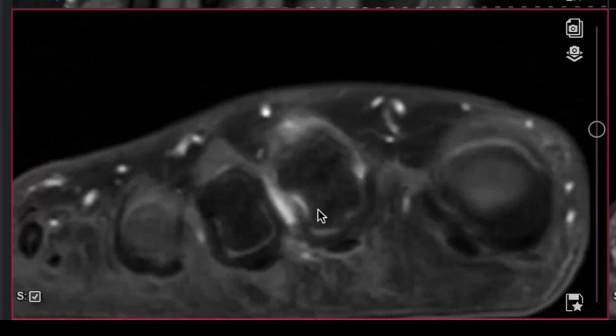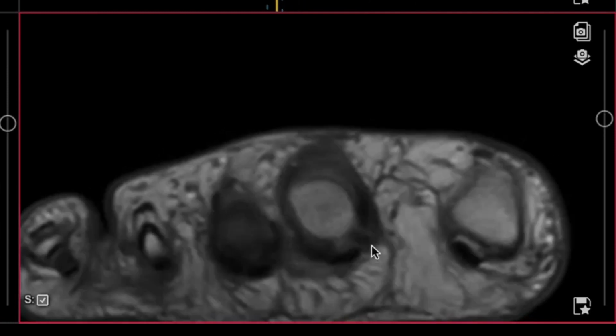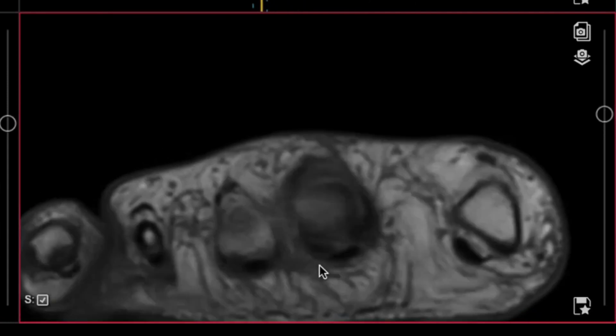So moving on from that point, looking at the plantar plate complex, understanding the increased pericapsular soft tissue thickening that I see here. Secondary signs such as a pseudoneuroma that we discussed are where we're going to assess this region of the interdigital nerve. This is the nerve. This is perineural fibrosis.